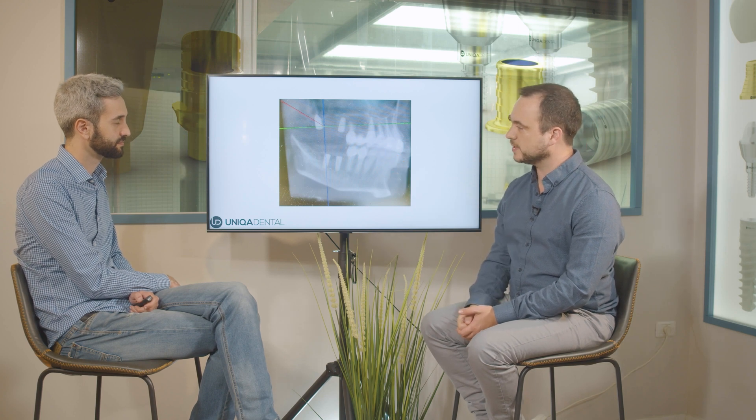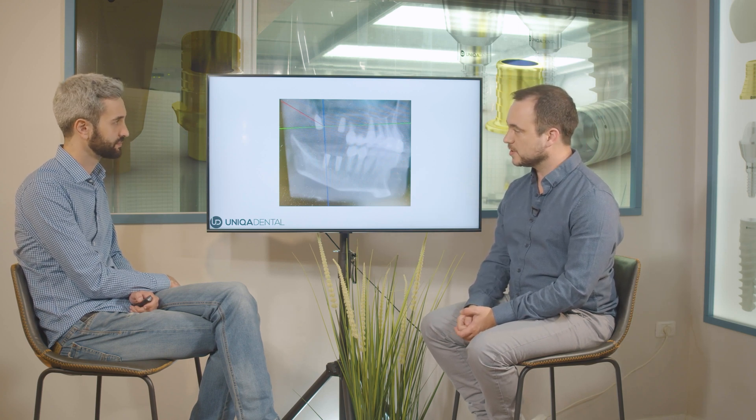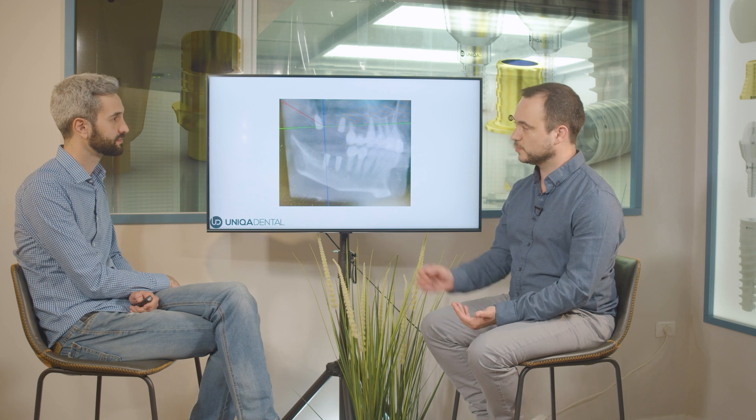Tooth 14 is a pontic and we'll place an implant instead of it. We're placing two implants before the procedure, we wait for osseointegration, then we cut the bridge between 13 and 14 and place the implant. This way, when we have two already osseointegrated implants, we can load all three implants — one just inserted and two already integrated — removing them slightly from occlusion for an aesthetic solution for the upcoming two to three months.